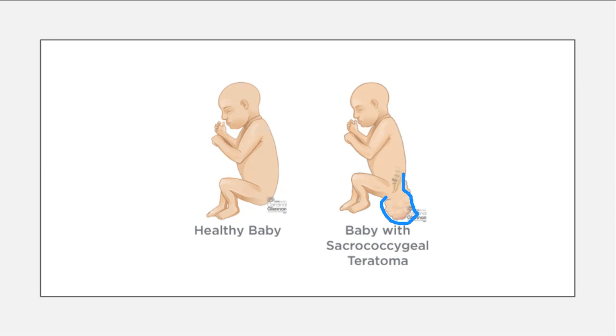So a lot of information on this slide. A lot of this information we are going to come back to as we start to piece together these different sectional abnormalities. So next module, I believe we're going to start talking about the neck and thorax. So we're going to walk our way down the baby's body. And then we'll be able to piece everything together once we wrap it up with trisomies and all of the other genetic conditions that are very common in the OB world.